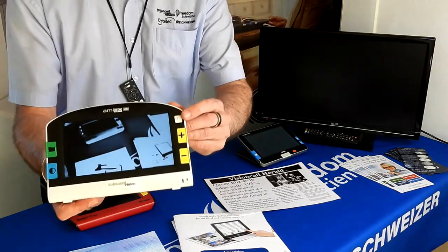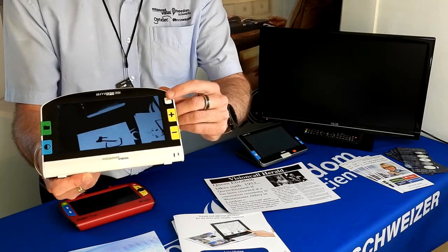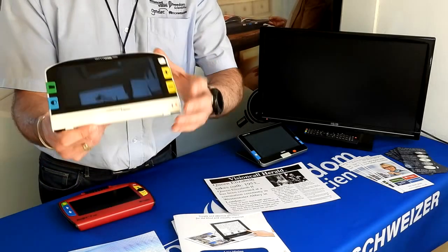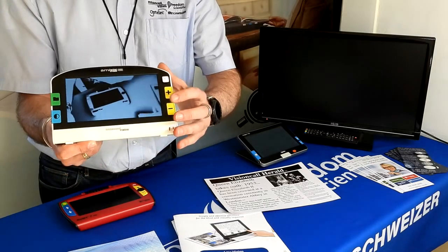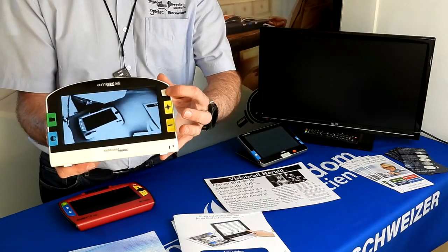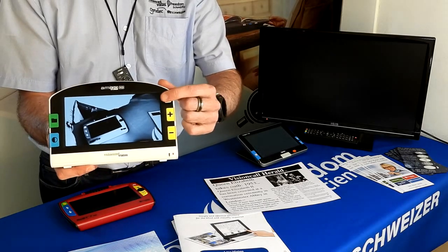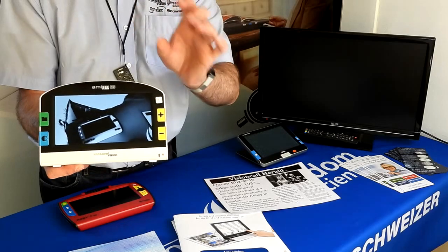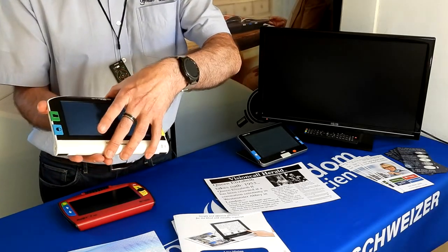The top button is a tactile joystick button. When you've stored an image and wish to review it later, you can click into the folder, open the image, and then maneuver it across the screen — up, down, left, and right — to find a particular part you're looking for. That's the Amigo HD.